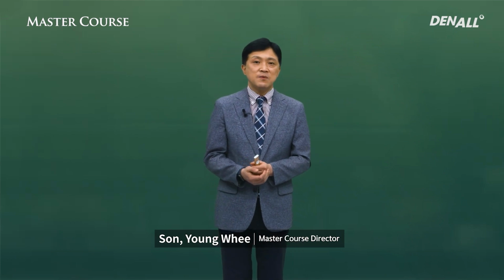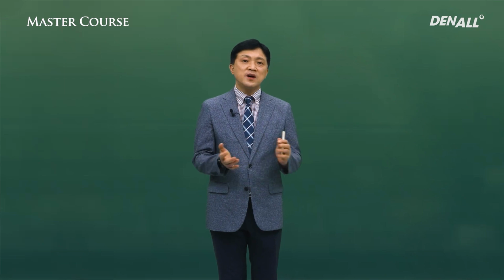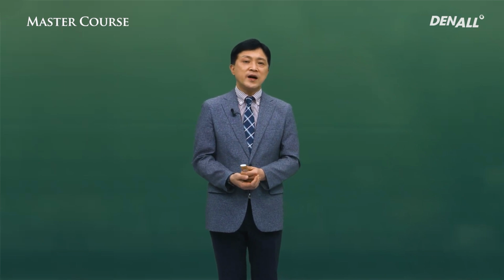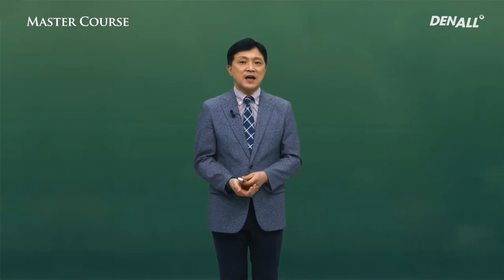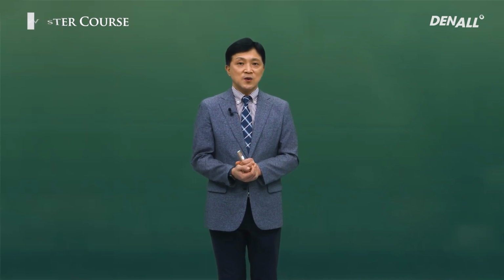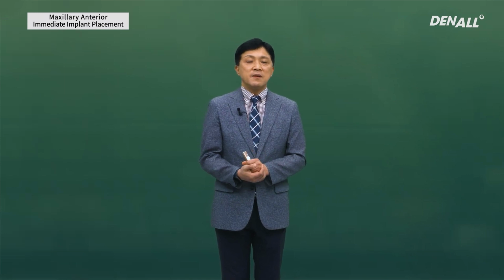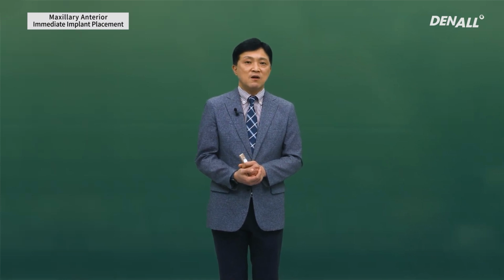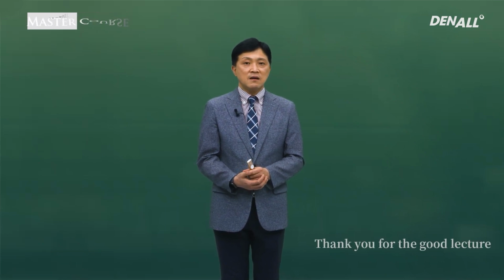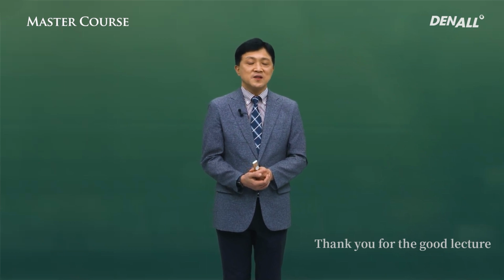Of course, immediate implant placement in the anterior maxilla has a wide range of scopes, and there are many other factors to be considered, but I have introduced some of the factors that I consider important. So please keep those in mind for immediate implant placement in the anterior maxilla for a better outcome. This is it for today, and I'll come back next time.